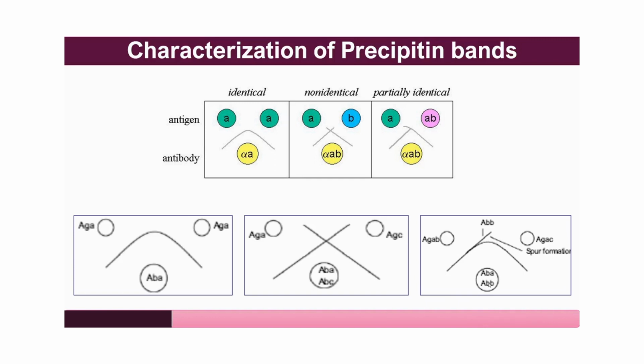Vice versa, if the concentration of antibody B is higher corresponding to antigen B, it would push the precipitin band towards the antigen. Therefore, one needs to be very careful while demonstrating precipitin bands. The concentration of antigen and antibody should be approximately equal, and if it is disproportionately higher in one, then it will form a soluble complex and no precipitin band will appear. Therefore, precaution is very important.